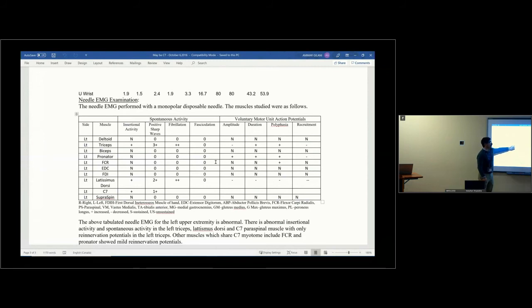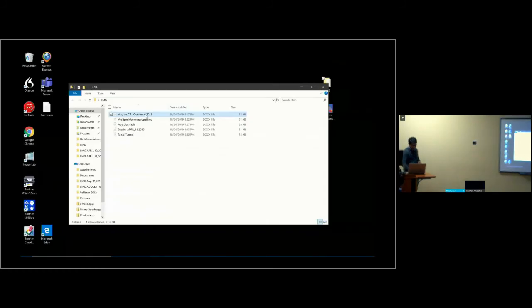So in this case, there was more of a problem with the lateral recess rather than at the neuroforamina. So it was giving a more fascicular pattern of involvement of the nerve. So this patient had carpal tunnel and C7 radiculopathy. So we can move on to another one.